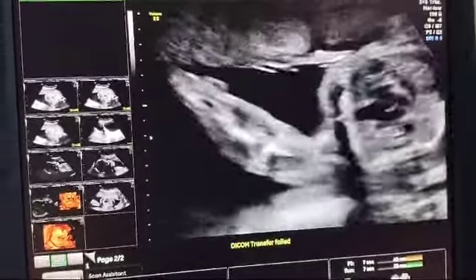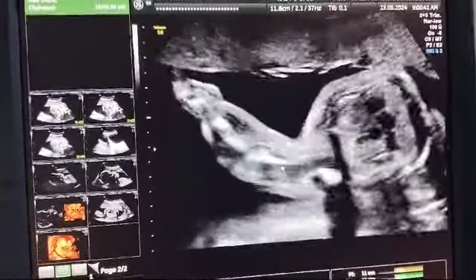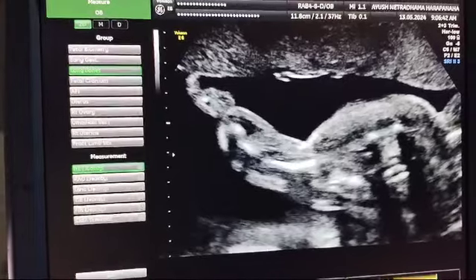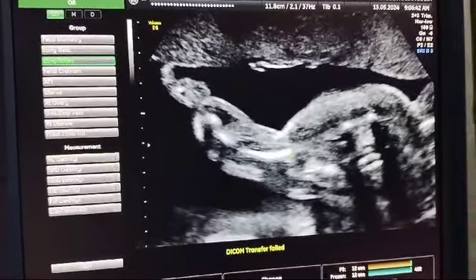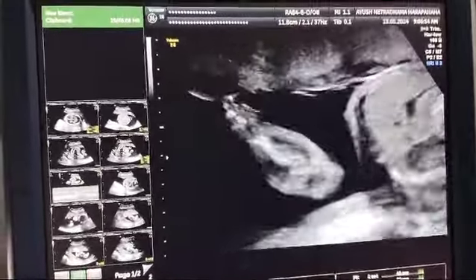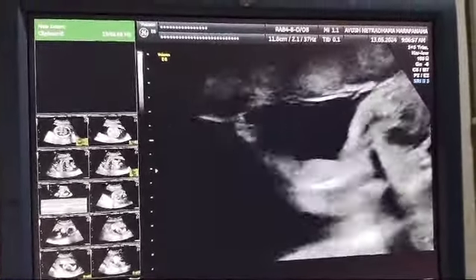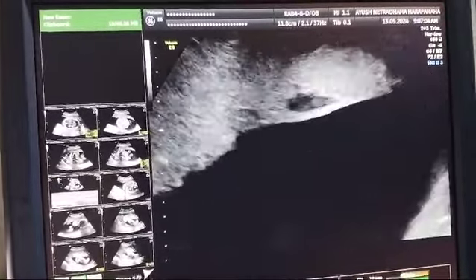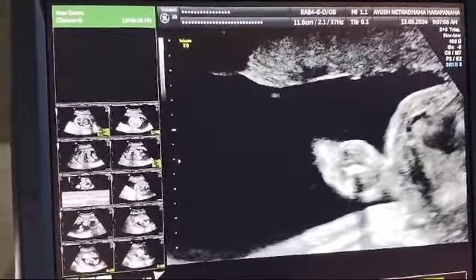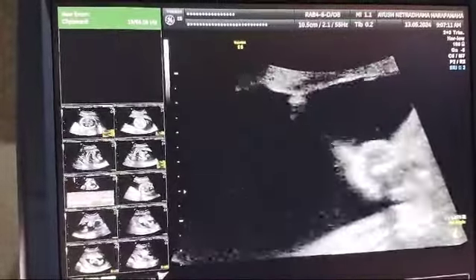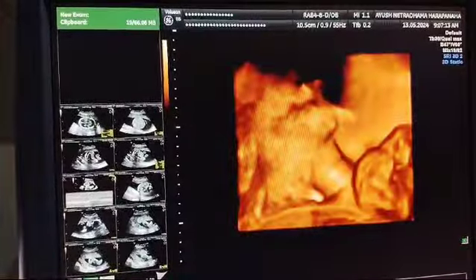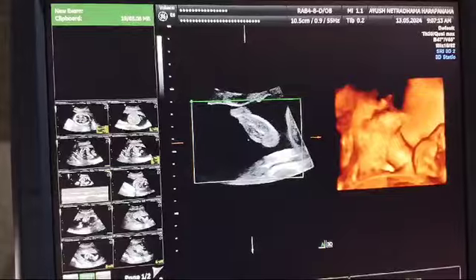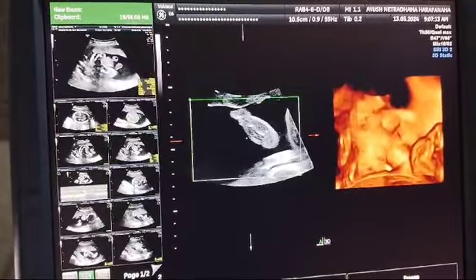Looking at the upper limb simultaneously — this is the thorax and upper limb — you can see that the humerus is shorter. This is actually a 24-week gestation, and when we try the measurements, the humerus is only of 16 weeks. Similarly, the radius and ulna are also short and there is bowing. When we look at the hand, the fingers are stubby, and the soft tissue around the bones is also thicker.